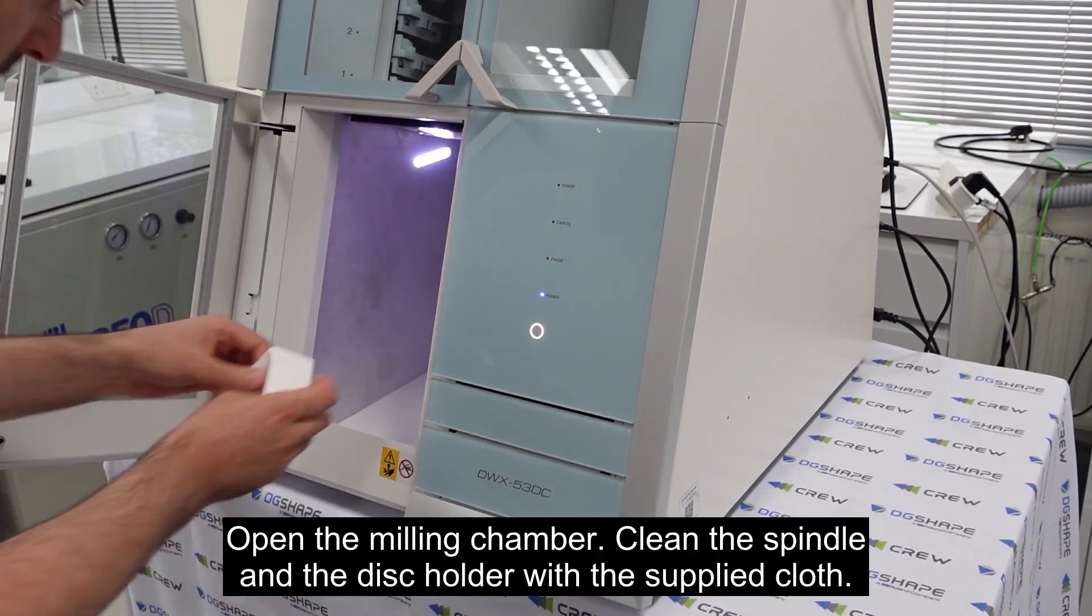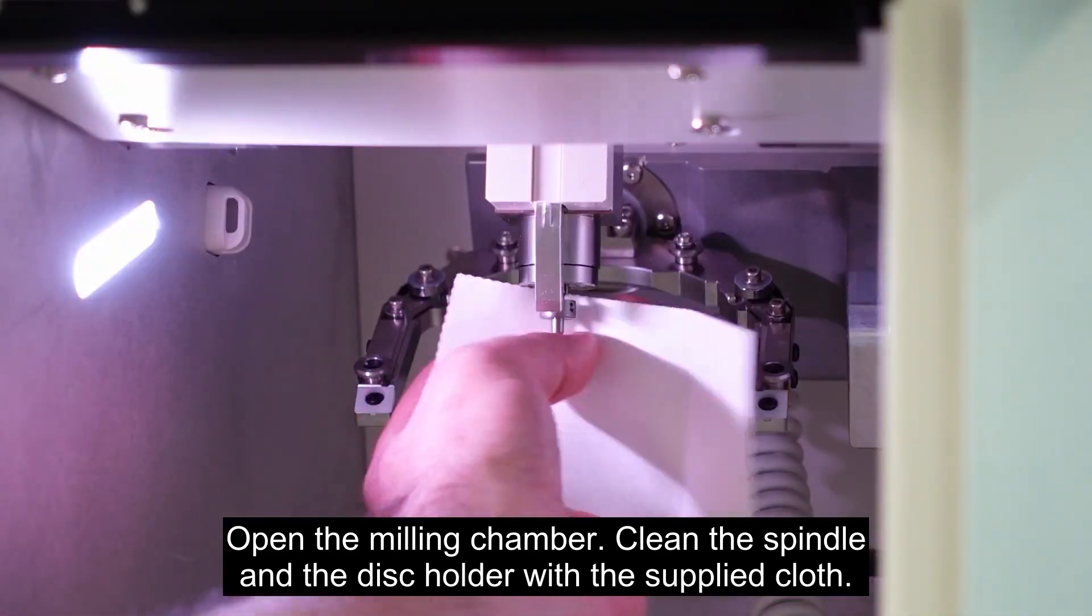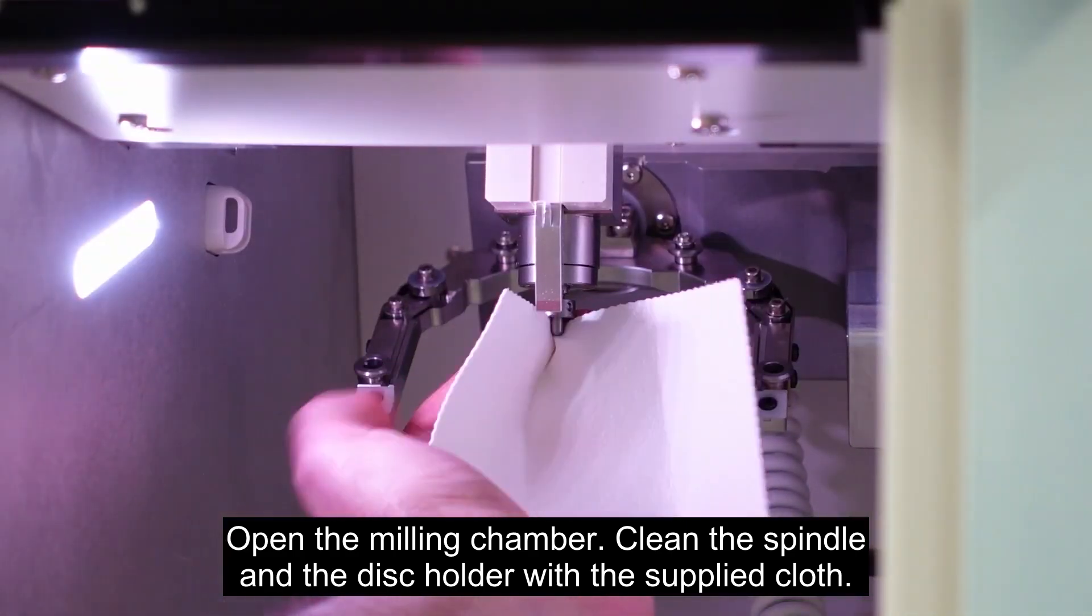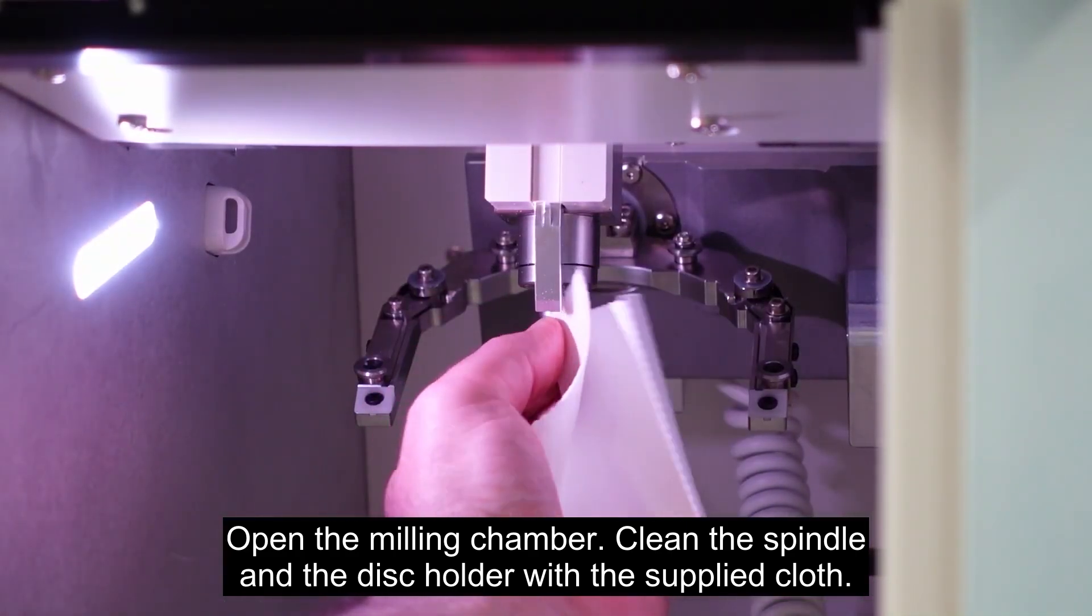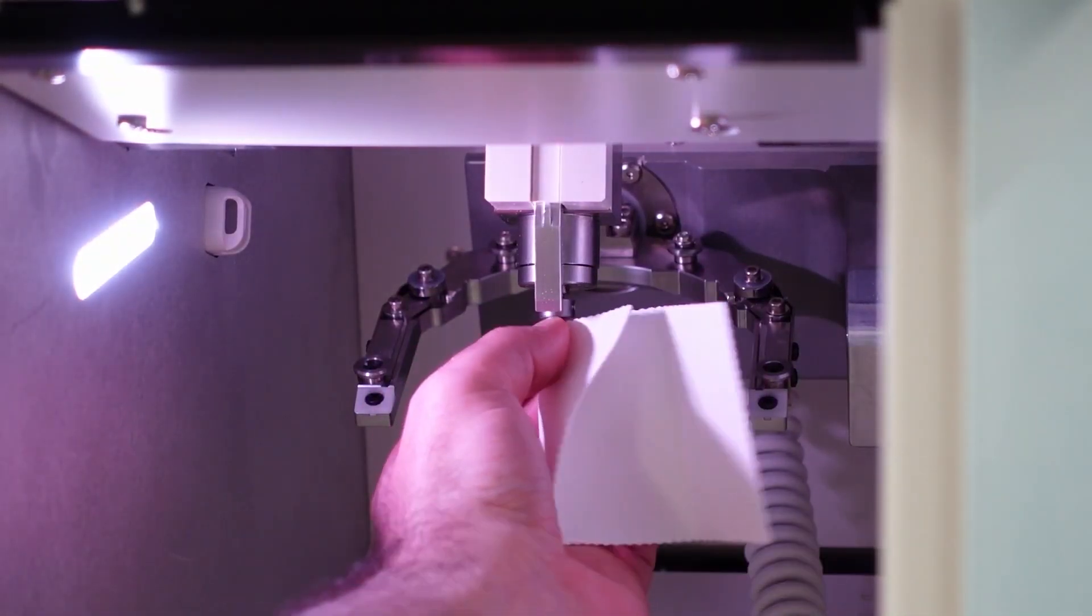Open the milling chamber. Clean the spindle and the disc holder with the supplied cloth.